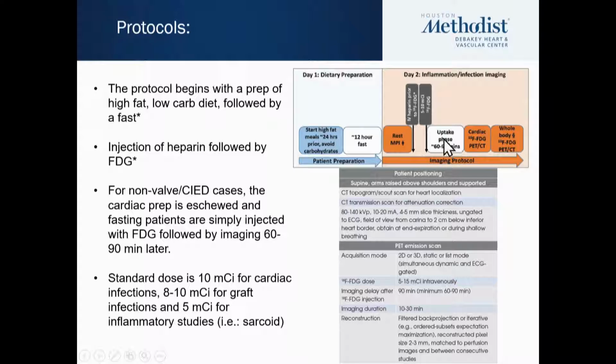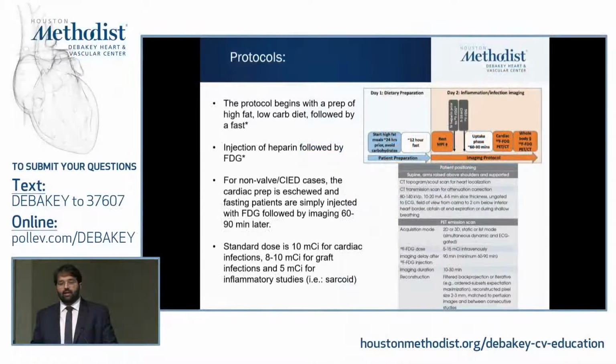We have an uptake phase from 60 to 90 minutes. At our institution, we typically keep it around 60 minutes. And then we do the FDG scan. Now, the prep is actually even simpler for cases where we're looking at, for example, LVAD infections or any kind of extra cardiac infection. We don't need to do this prep.